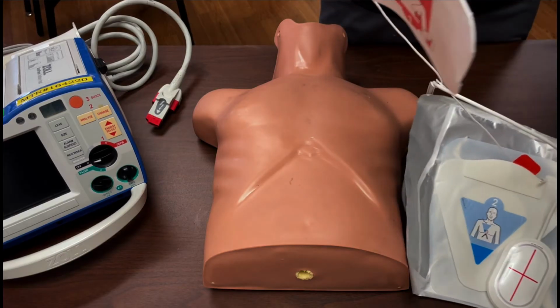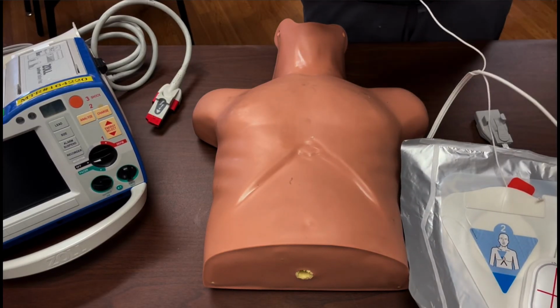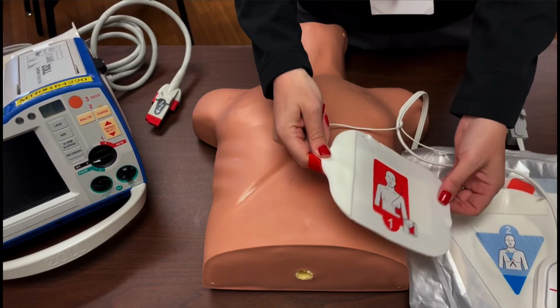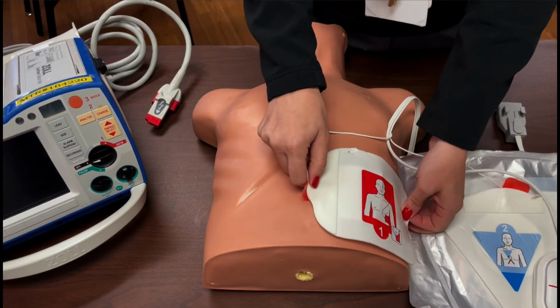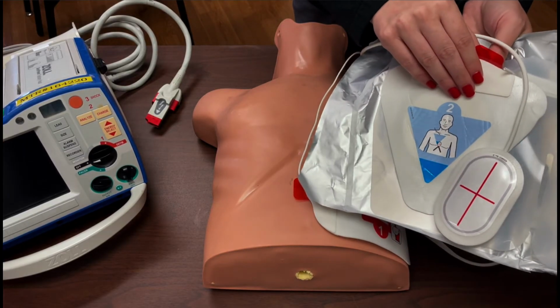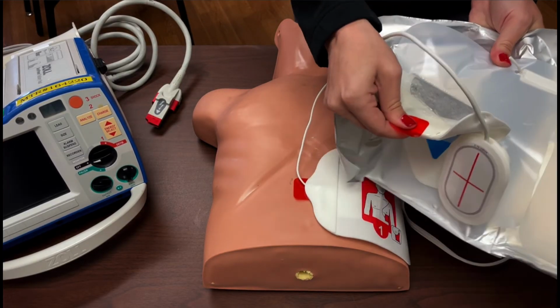The first pad is a red rectangular pad, and it's going to go at the bottom of the pectoral muscle of the male or under the breast of a female, like this. Same thing with the second pad. You're going to use the red tab to remove it.